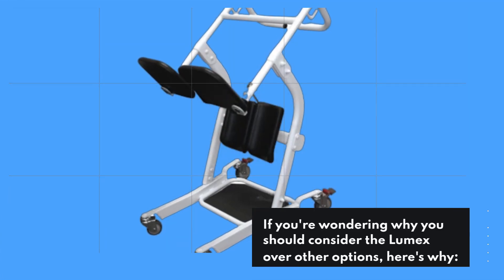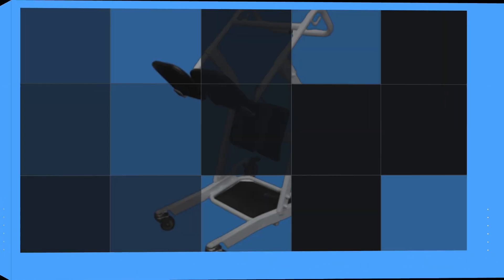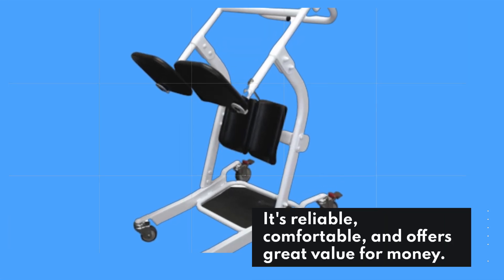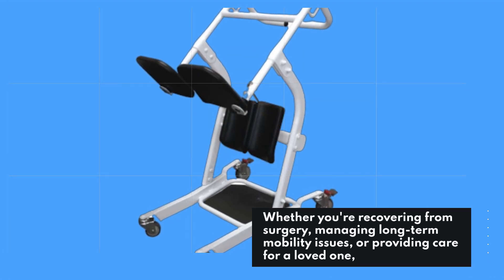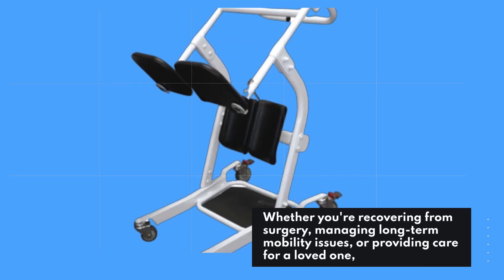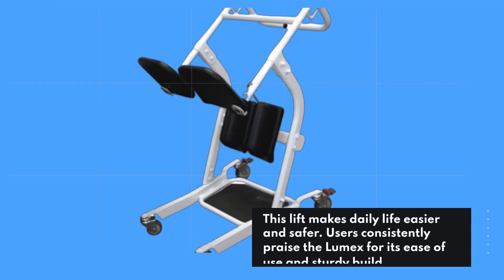If you're wondering why you should consider the Lumex over other options, here's why. It's reliable, comfortable, and offers great value for money. Whether you're recovering from surgery, managing long-term mobility issues, or providing care for a loved one, this lift makes daily life easier and safer.